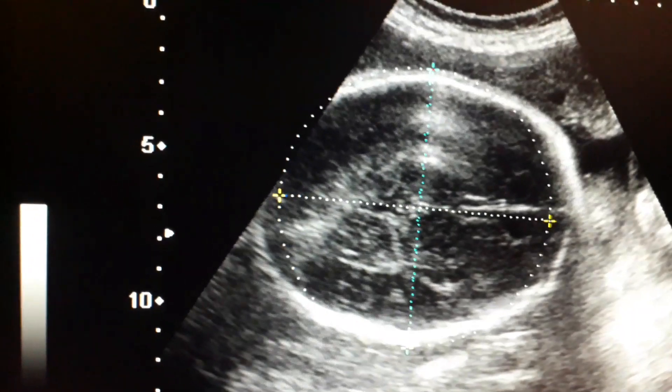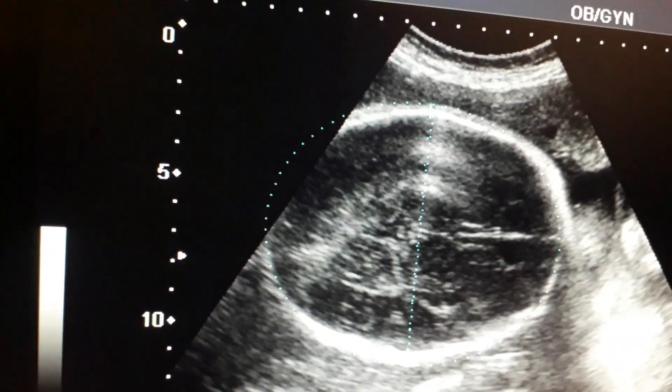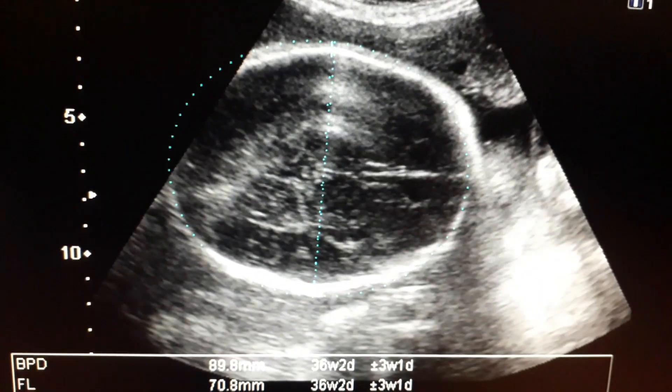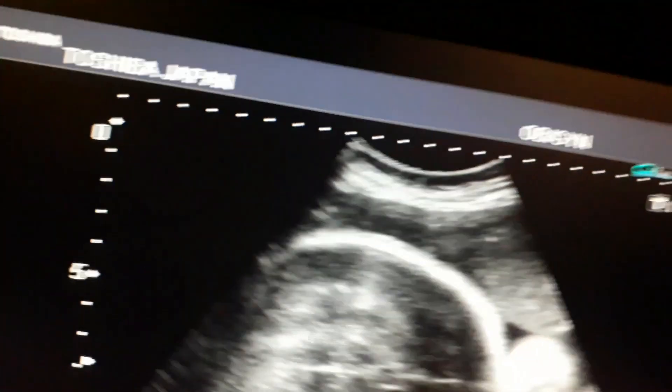This video will also show you the position of the placenta in the breech position — its lower lobe and the end of the lower lobe — and at the end we will show you the gender of the baby, which is a male baby.